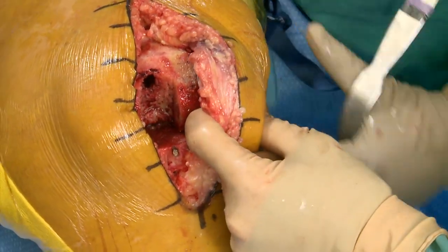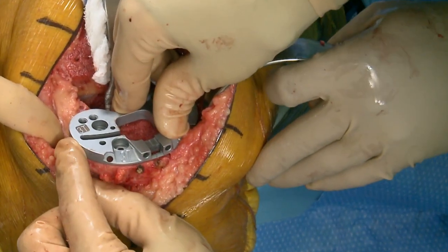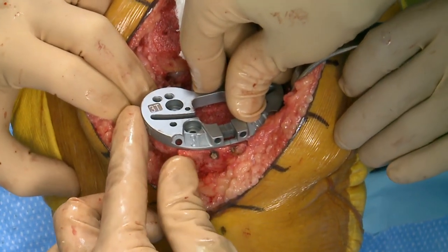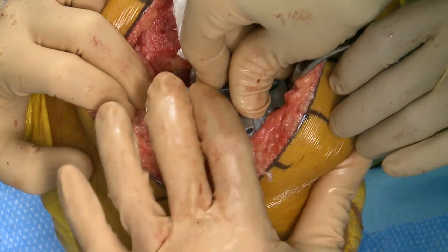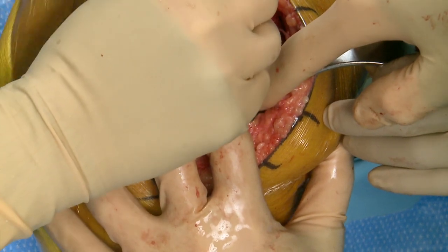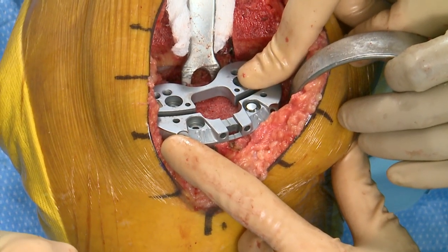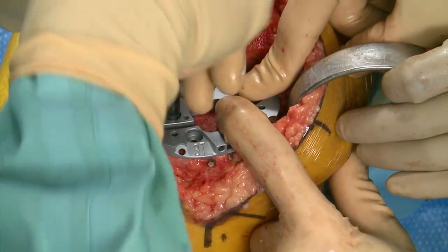We're putting the size 3 base plate on. I'm flush up against the medial side where my rotation is marked, translating it, checking the lateral side — well covered and not overhanging. We'll pin this. Matt just pressed it in with his bare hands without even a mallet. Every day I'm a little more astounded at their skill level.